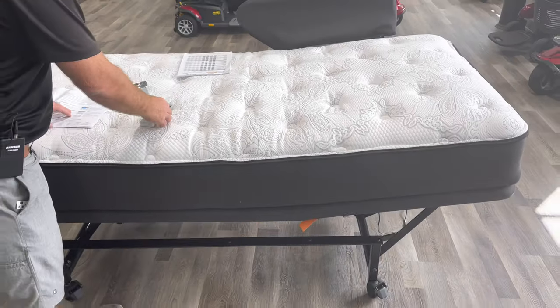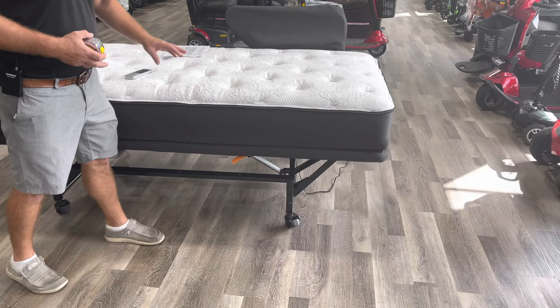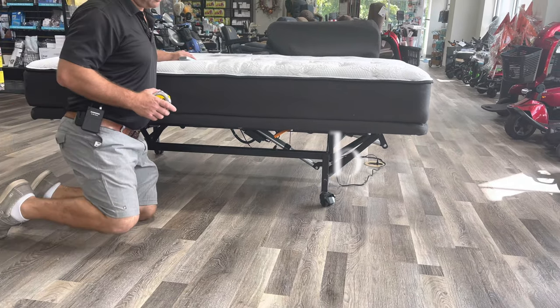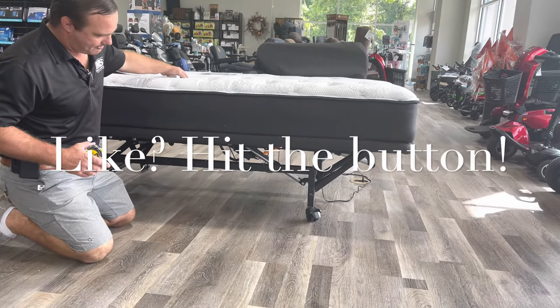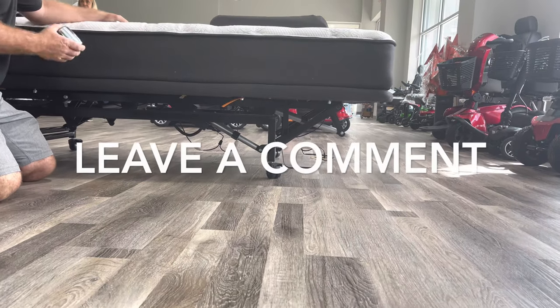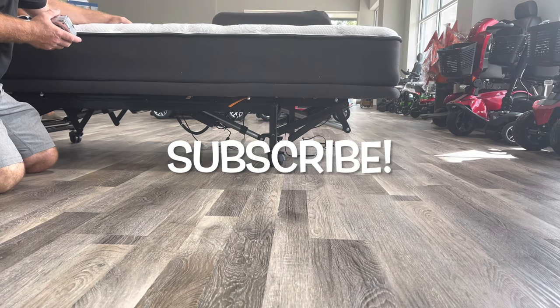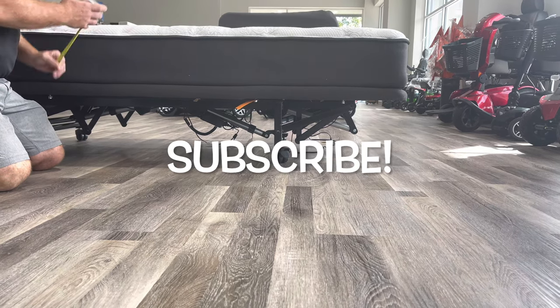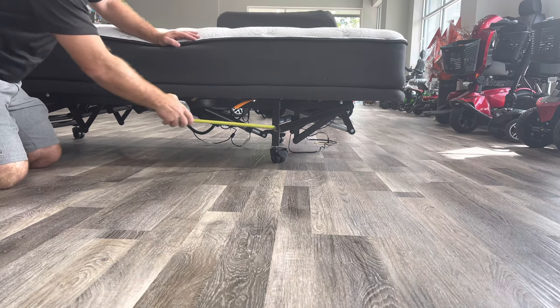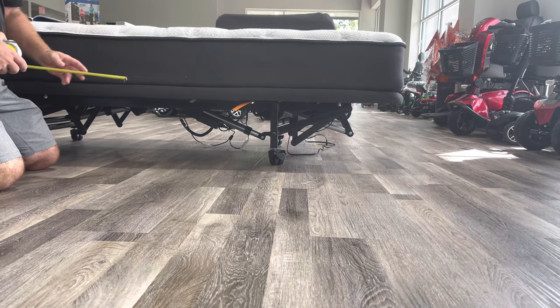A key thing is determining exactly how low you need the bed to go and how high you need it to go. At the lowest point it's 22 inches. Remember you can remove these casters, and if you need it even lower than that, order it with a low profile mattress.